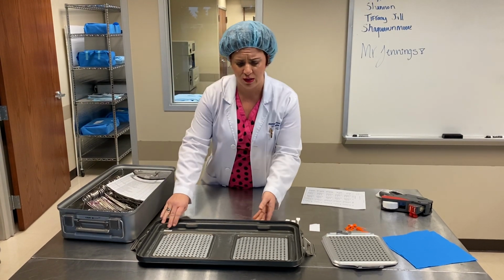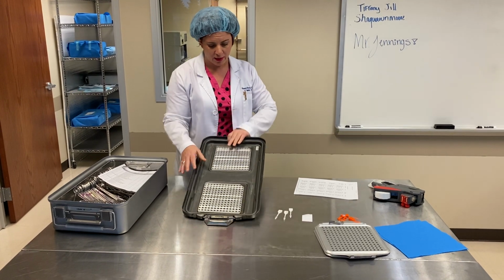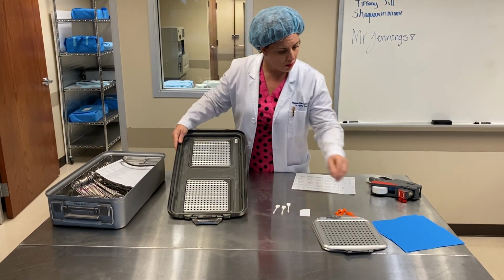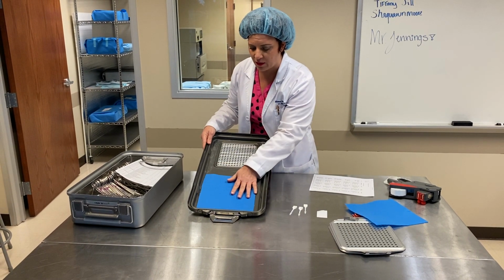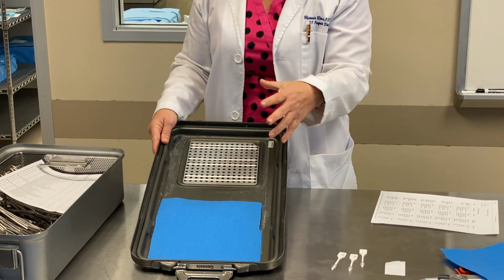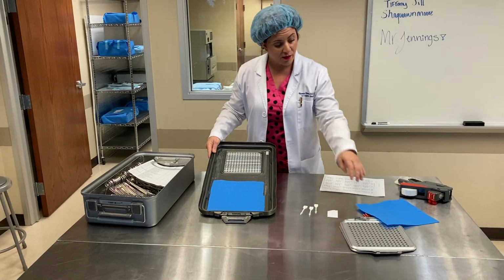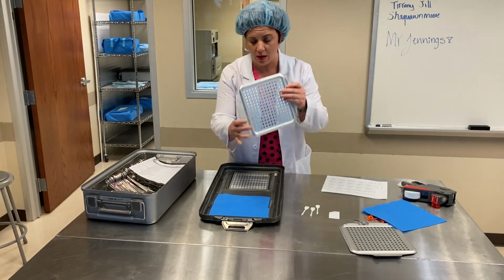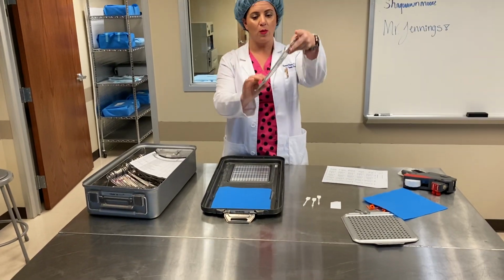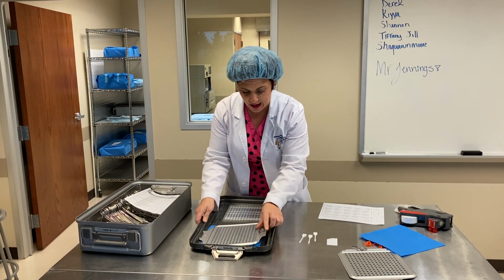The next thing we have to do is put some filters in the top of this lid. These filters come in different sizes and shapes. Some are round, some are square, some are rectangular. So you want to make sure that you're getting the right filter for the right tray. I'm just going to set that in there like that. This has only one way that it goes. It says top here and kind of hooks under there.